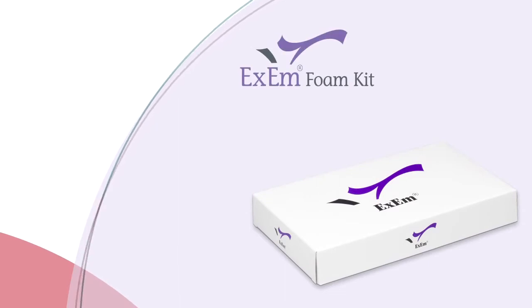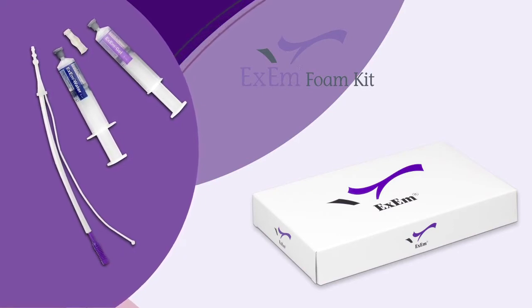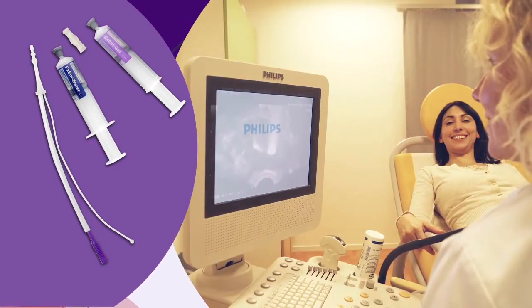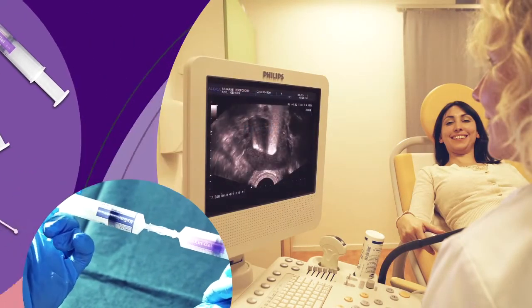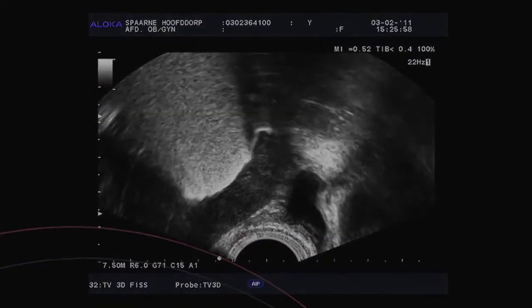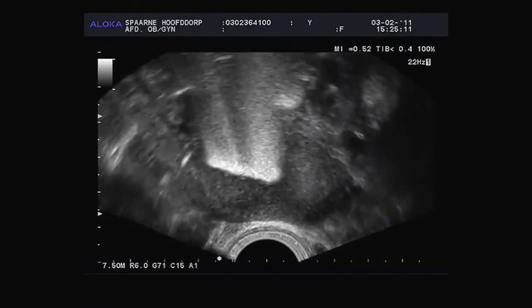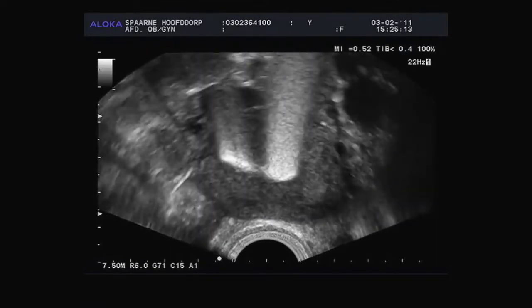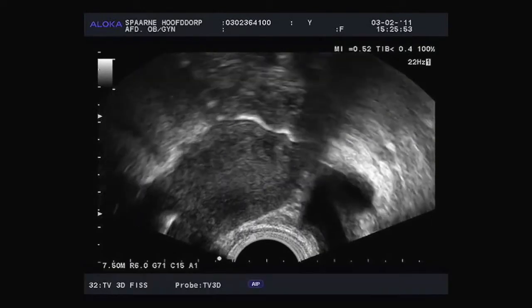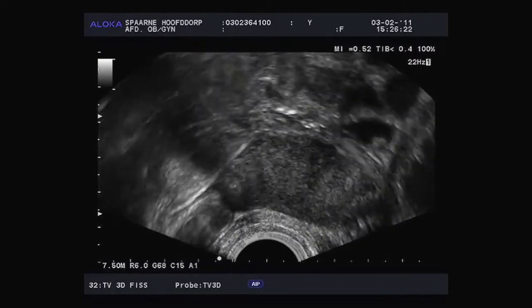ExEm Foam Kit is simply an improvement on the old HyCoSy technique. The difference lies in the composition of the gel. It represents a great improvement on the no longer available Echovist, and has no adverse effects, which was sometimes the case with Echovist. ExEm is a safe gel that, when mixed with purified water, creates a tubal foam with millions of tiny air bubbles. As air is a poor conductor for sound, the ExEm tubal foam provides a very accurate ultrasound image. Millions of tiny air bubbles create a mass of small white dots which make the image very bright and white, providing a clear view of where the foam is.